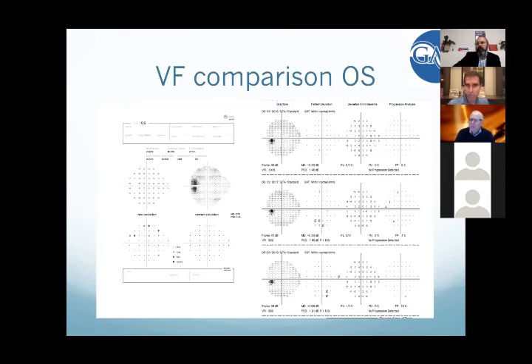But it's pretty low, and in most patients that were admitted in Singapore and even out of Wuhan, the initial hospitals, who were PCR positive with COVID, they had a very hard time isolating viral particles from the tear film, and there's been very little evidence they've actually been able to culture the virus from the tear film. That's good. But it's still a theoretical risk that we need to be aware of. Exactly. And the fact that a patient breathes into a big bowl during a Humphrey for 10 minutes, and then another patient comes in and breathes into it.